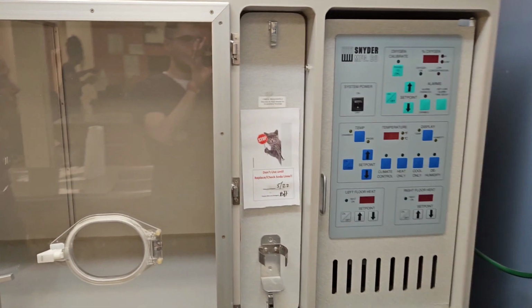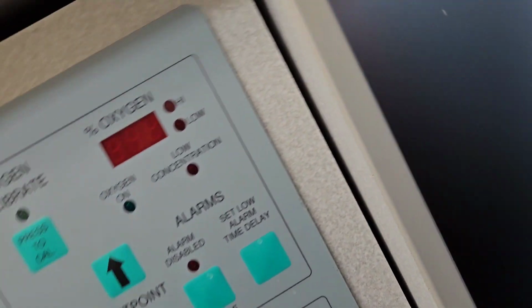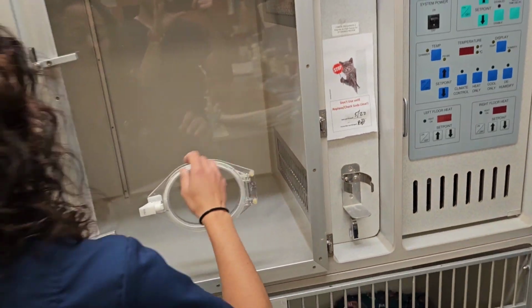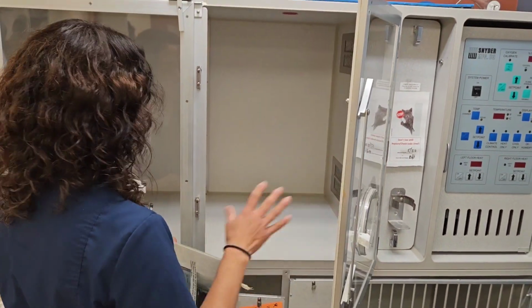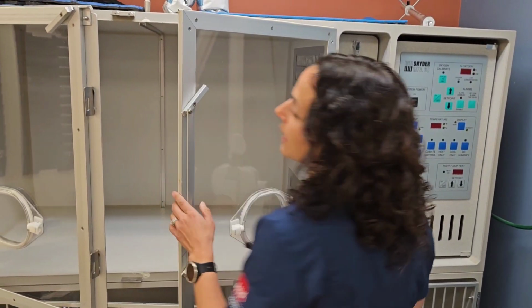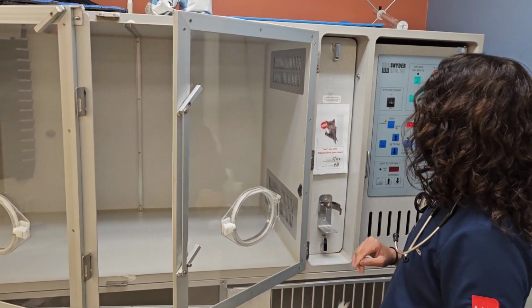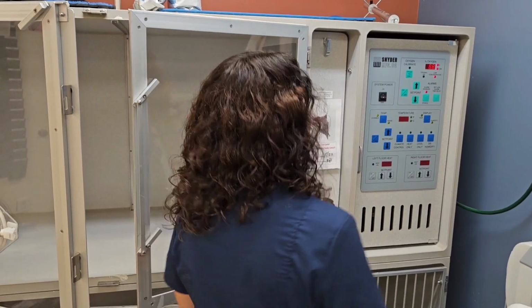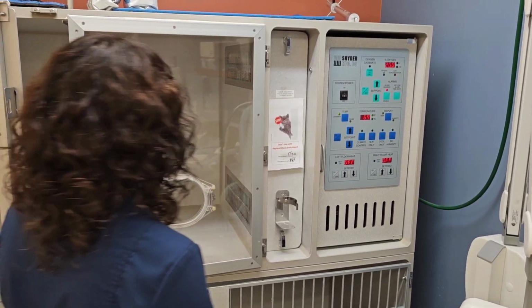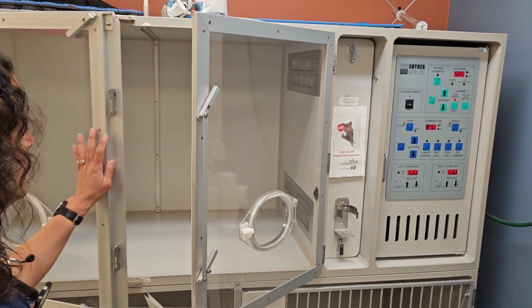So the first thing we're going to do is make sure that the oxygen on the flow meter, which is over in the corner, is off while we do all the calibrating. So now I'm going to open the doors when we calibrate, just to make sure that if there's any oxygen in the cage, we let it out. I'm going to turn on the machine. All of our fancy lights are on now. I'm just going to keep these open for a second, let any oxygen that's in there drain out.